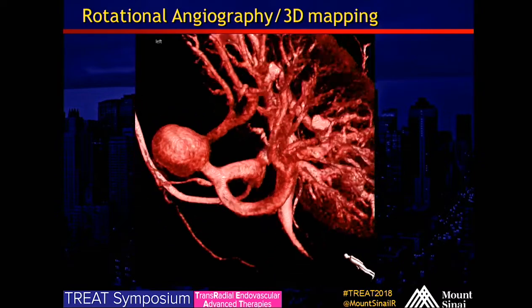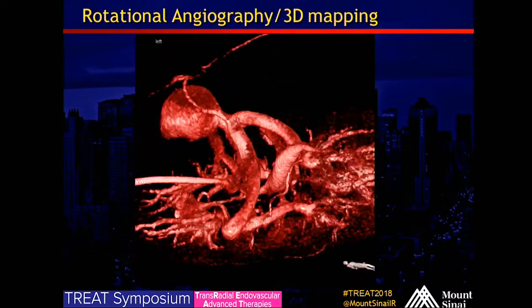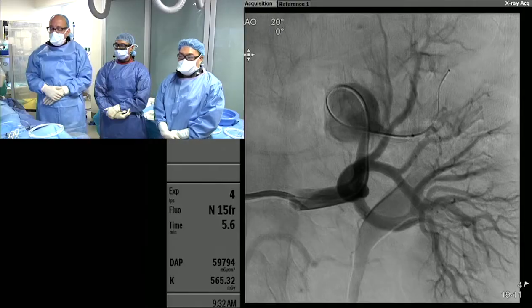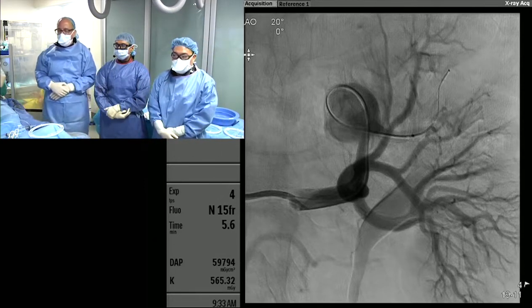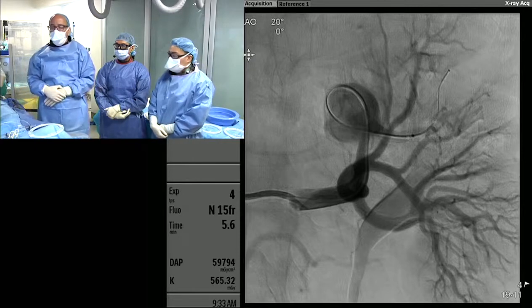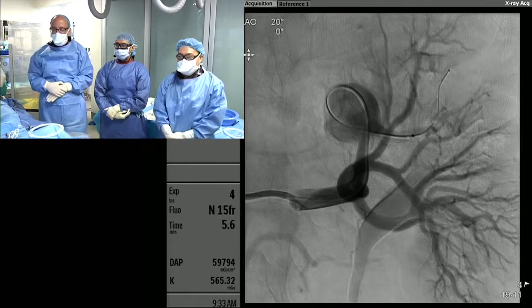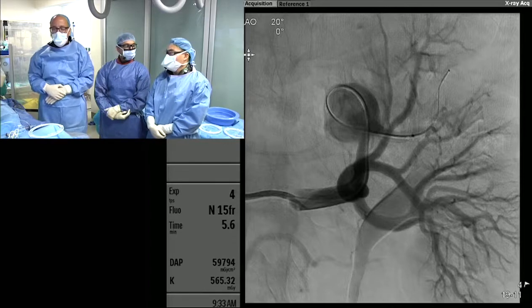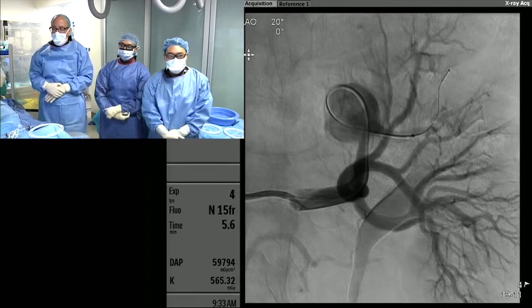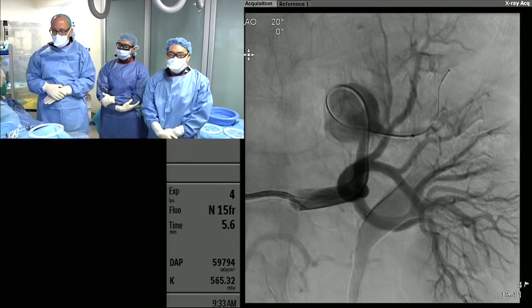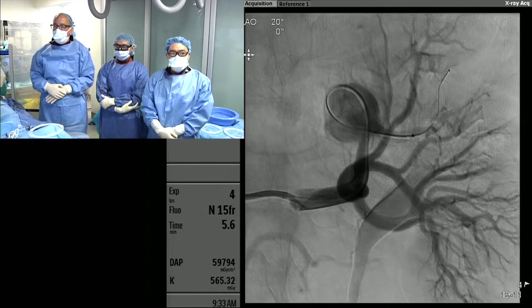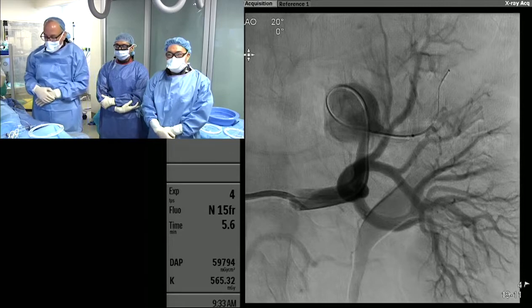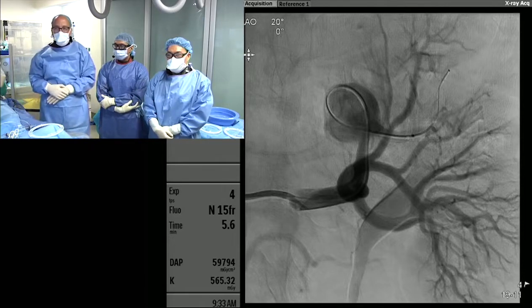Basically it's a vessel that is diving inside the aneurysm. The other kidney has an aneurysm as well — a 12-millimeter true bifurcation aneurysm that really almost looks like a basilar tip aneurysm. We're not going to treat that one for size concerns; it's going to be a much more complex reconstruction, and I think the collateral damage will be minimal if any.